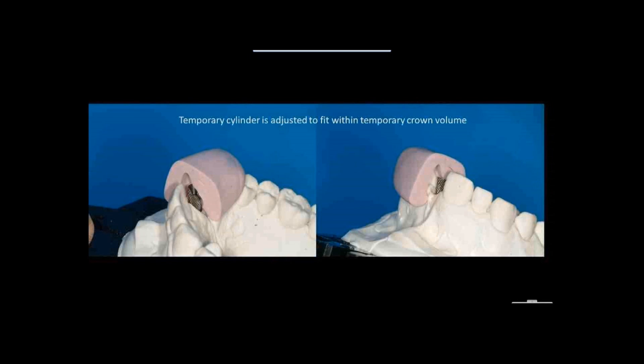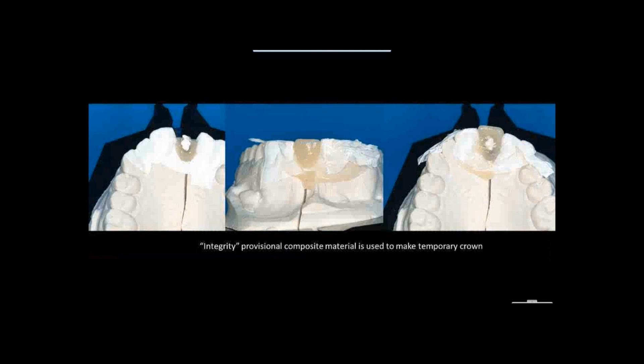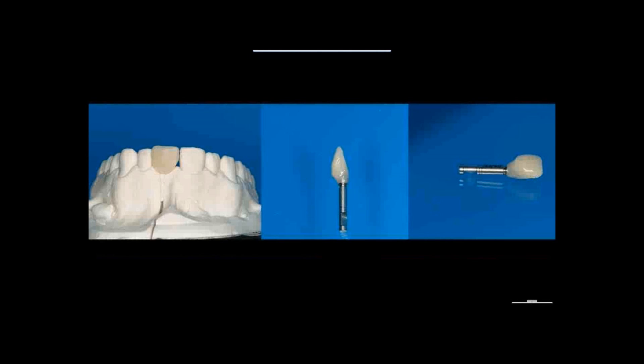Every dentist should have plumber's tape — polytetrafluoroethylene tape — in the office; it works for everything, including isolating what we're about to do. I inject a regular temporary crown material into the little shell we made, place this contraption in, then remove the plumber's tape and clean up. Step by step, we use a little flowable composite to generate the emergence profile we want for this tooth.